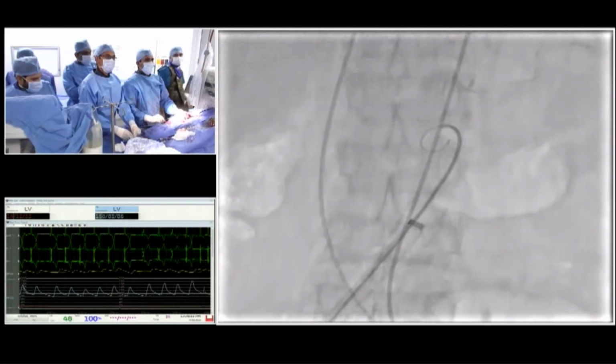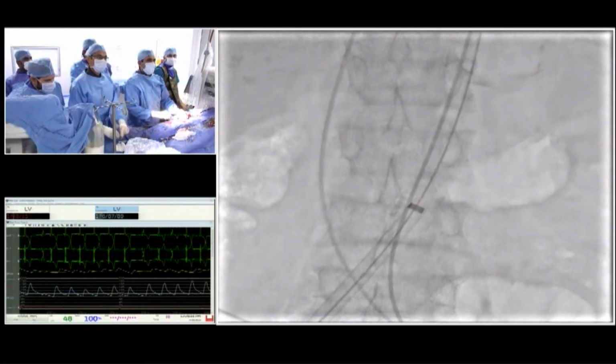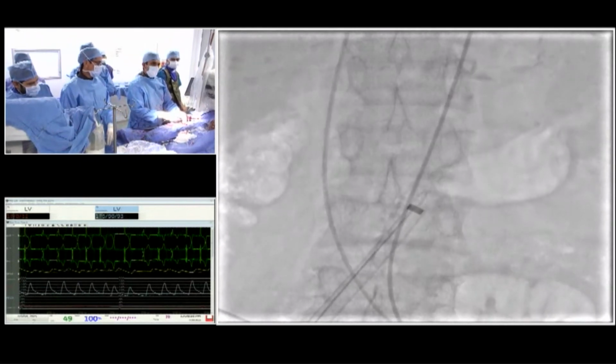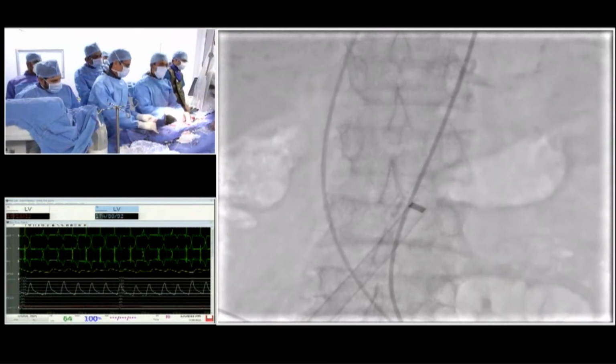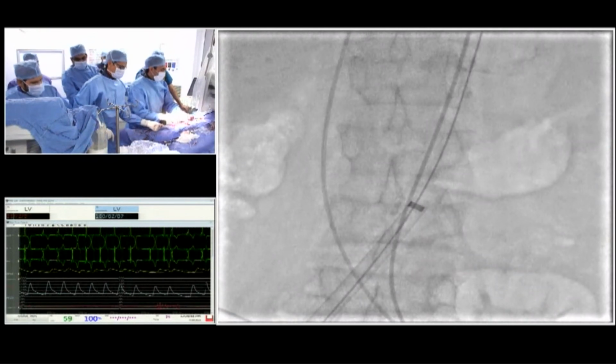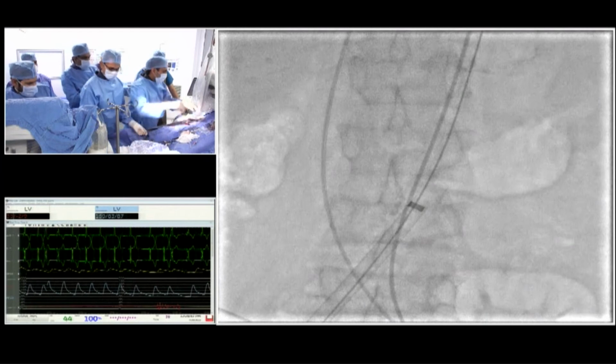Okay. I think, Ravinder, you did a great job of demonstration of Sentinel in this case, and balloon expandable valve, the simplicity of deploying also you've shown it enough. You did it in shorter time than angioplasty. Congratulations. I think closure devices, we can see it further, but if you're okay, show us the filter, then probably we'll move on.